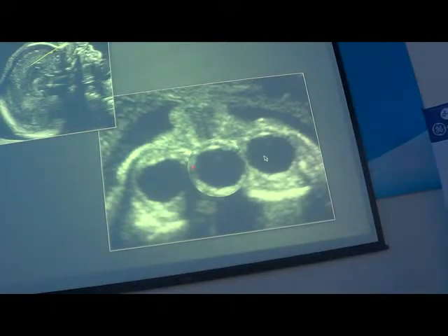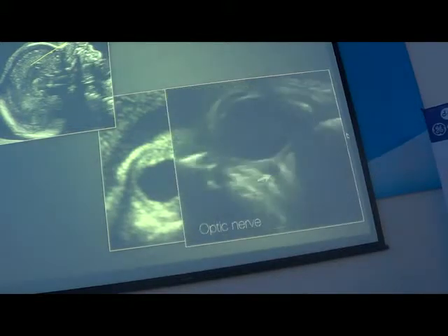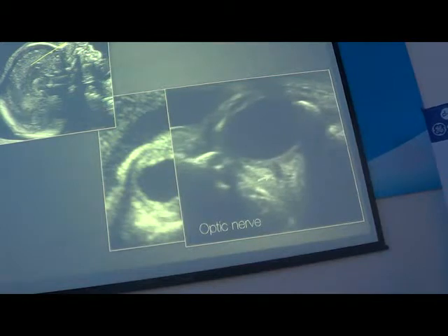If it's more, that means you have a hypertelorism. If it's less, that means you have a hypotelorism.